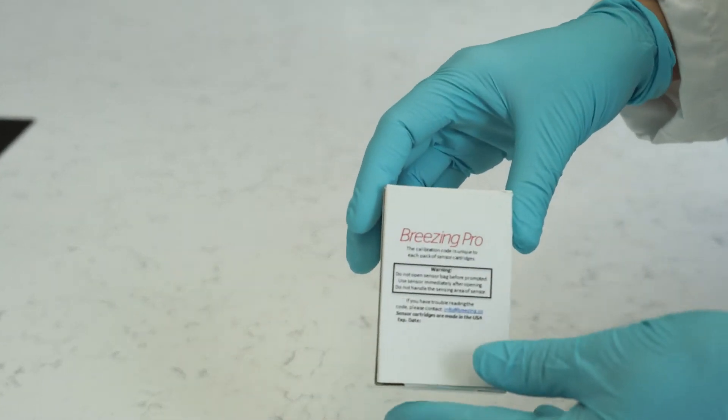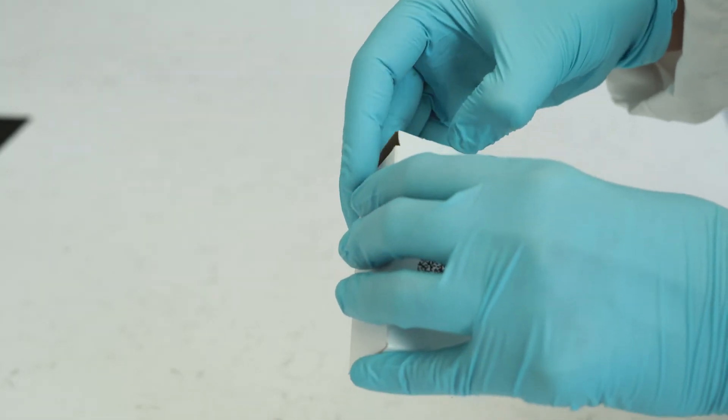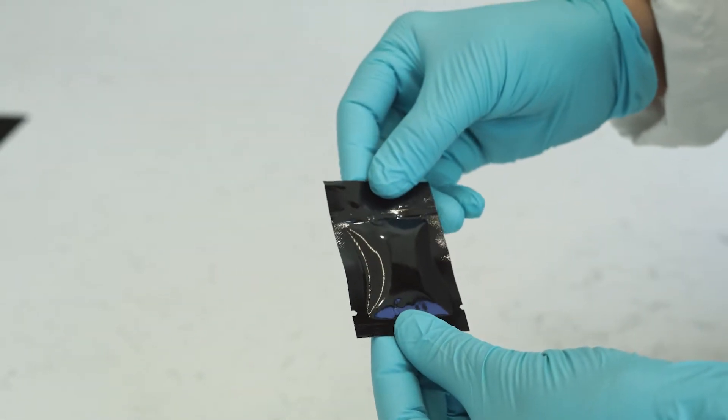The sensor cartridge is one-time use. It comes in a sealed pack and must be opened right before use. Once the sensor is exposed to air, the measurement must be conducted immediately to avoid degradation of the sensor. Typically, one to two minutes of exposure before starting the measurement is acceptable.